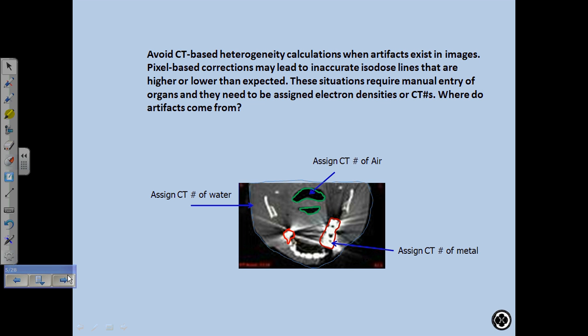Question is, if you have an organ inside an organ, say your tumor volume goes into your small bowel, but you imaged your bowel with contrast. So you gray out your bowel, and there's an overlap.